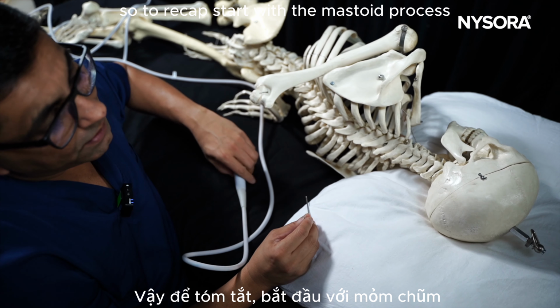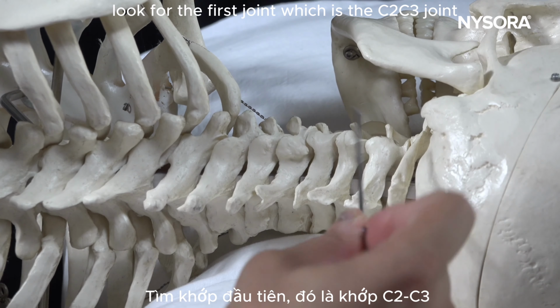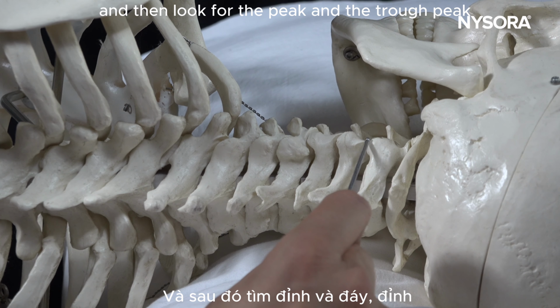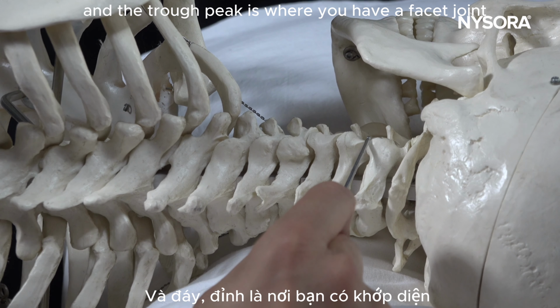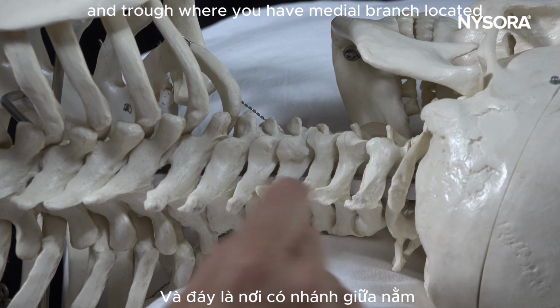So to recap, start with the mastoid process, move down, look for the first joint, which is the C2, C3 joint, look for the third occipital nerve, and then look for the peak and the trough, peak and the trough. Peak is where you have a facet joint, and trough is where the medial branch is located.